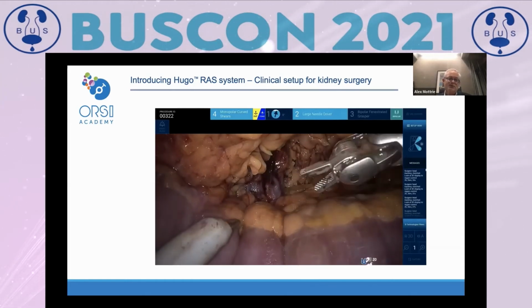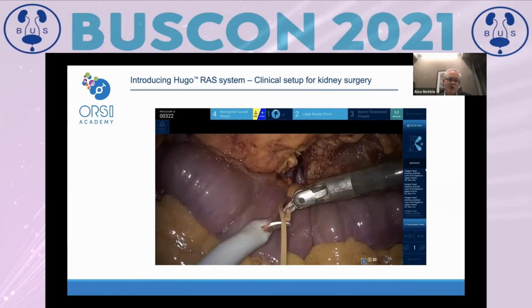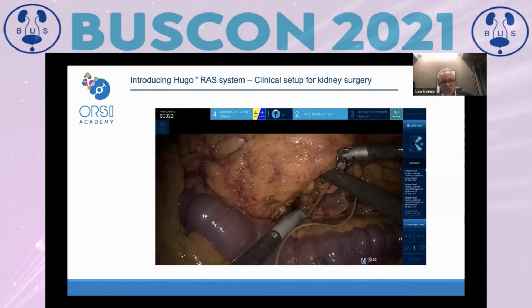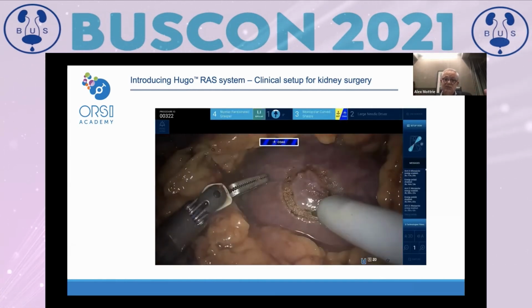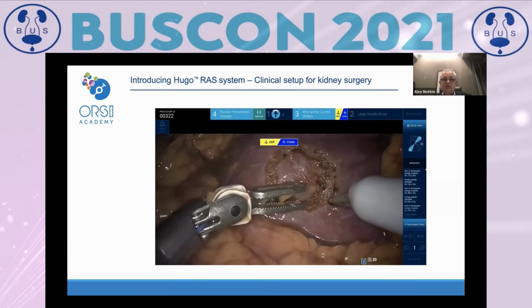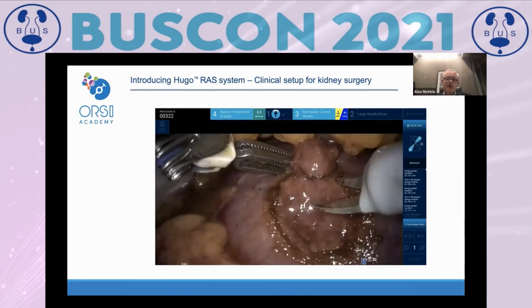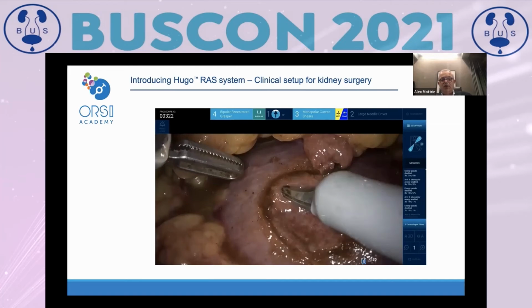Here you see the vessels, and then we will go for a convenient partial nephrectomy. I can tell you that we did one together with Jim Porter in order to optimize the trocar positioning, and after having done a partial where we have put the trocars only for this partial, then we said together, why don't we go down and see how far we come, let's say, in case we want to do a nephroureterectomy. Well, this was unbelievable. We could, without changing the robot whatsoever, reach the distal ureter without any problem.